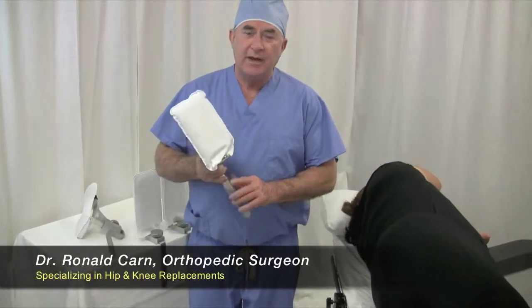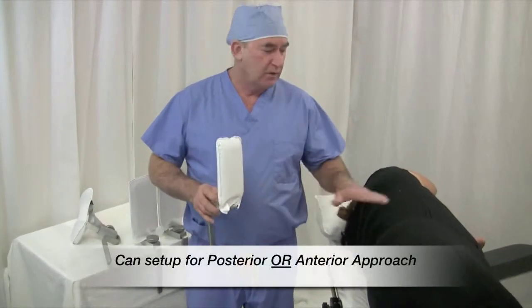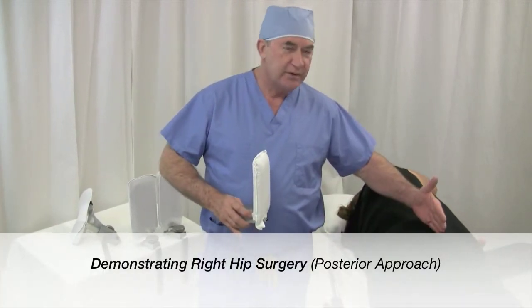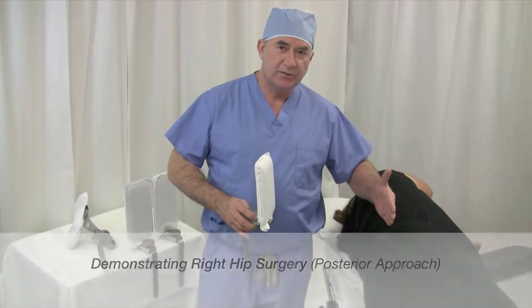I'm going to demonstrate how to apply the HipGrip II for lateral positioning, posterior approach. The general principle is the patient is close to the surgeon.